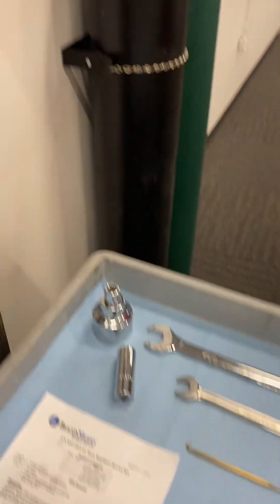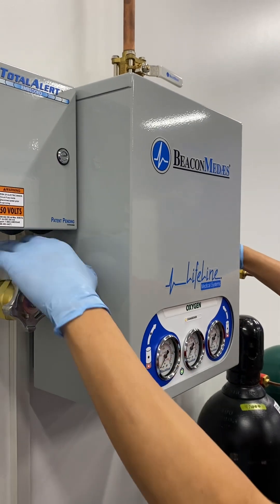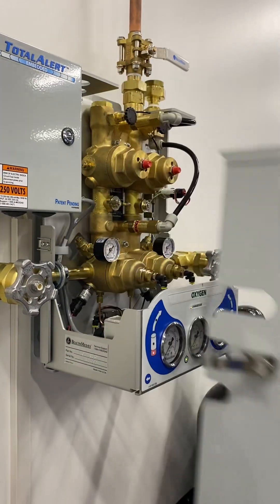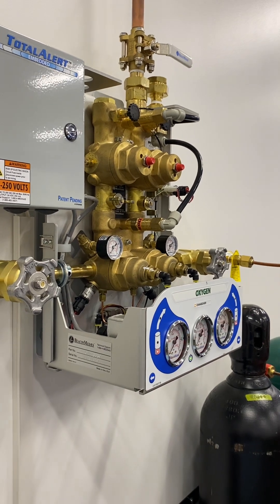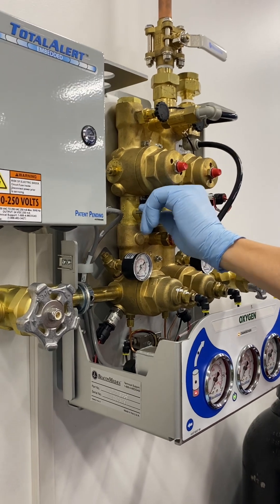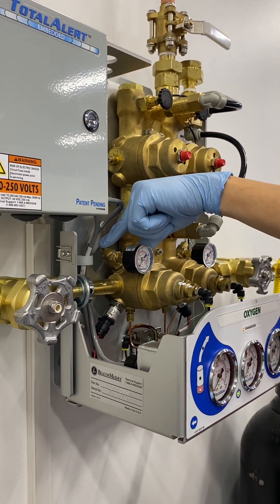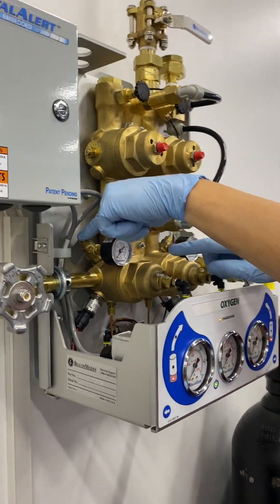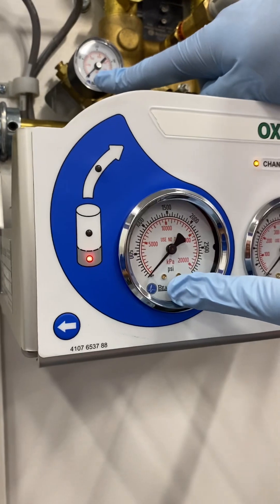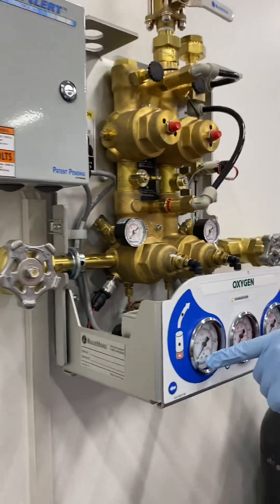We'll start by pulling the cover off — there are two clips, one on either side. We'll need to isolate the bank. Today we're going to work on the left bank, so we've isolated the valve there. We've closed our master valve and pressed our relief valve to make sure we've got no pressure. No pressure on the bank regulator gauge here, no pressure on the gauge there, so we're sure that we're at zero.